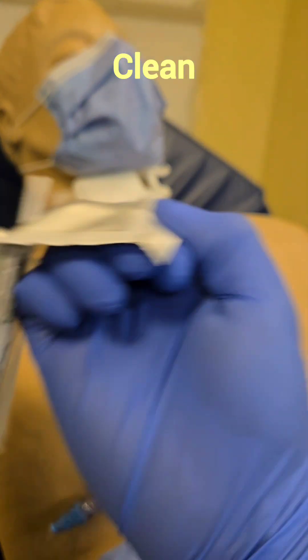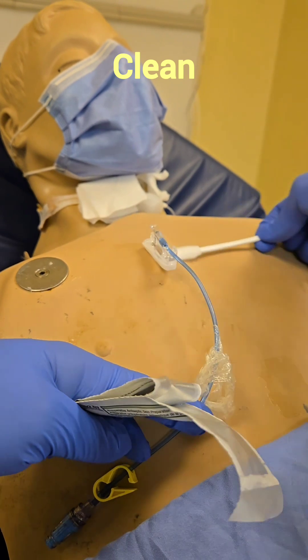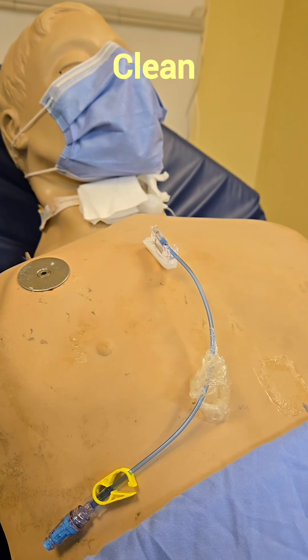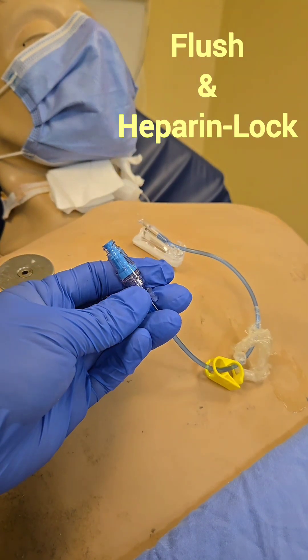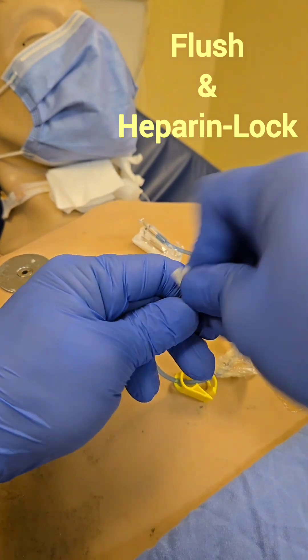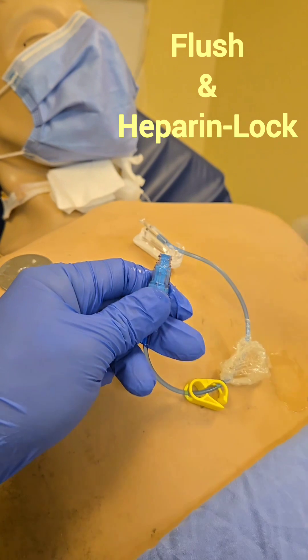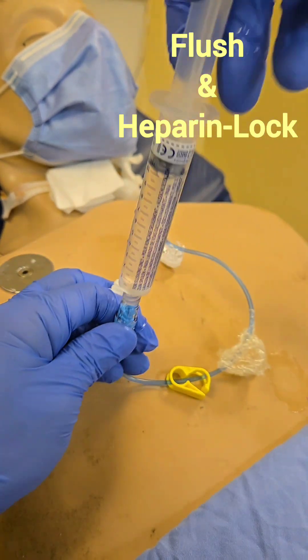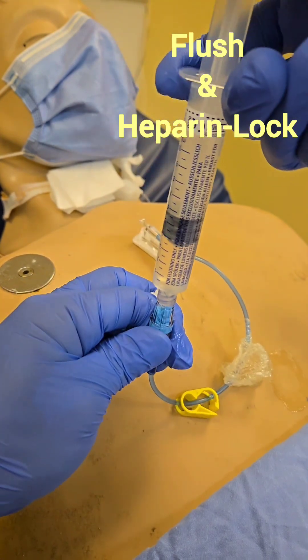Next, clean the site — go around it to make sure we do it cleanly. After that, flush the line one more time to make sure there are no clots staying behind. Use your saline flushes with the push-pause, push-pause, push-pause technique.